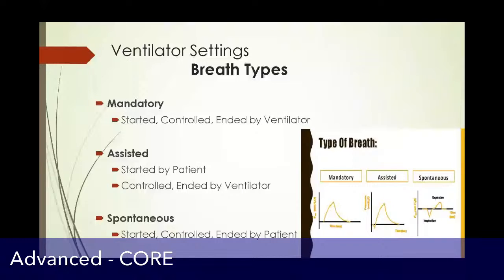The third type of breath is a spontaneous breath. This would be someone who you're weaning from the ventilator and thinking about extubating. You're letting them start their own breath, take the air into their lungs, and then exhale all by themselves. More physiologic.